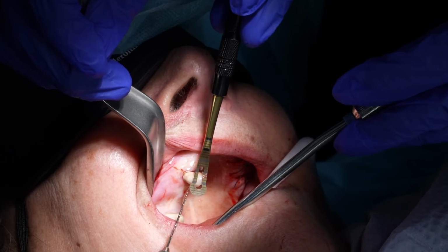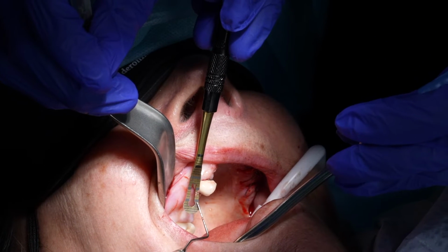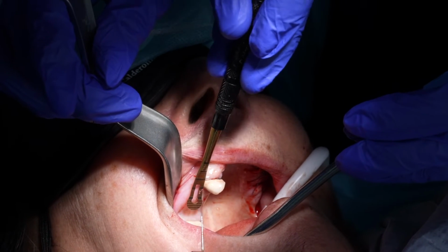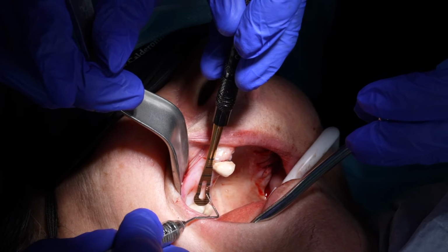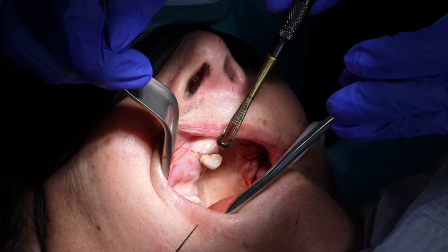Or I can use the fancy instrument over here that I'm showing you, which each line is 1 millimeter until you get to the wide line. Then it's 5 and 6. So every wide line is 5 millimeters. So if I put this right against the tooth here and come over here, 17 millimeters. 5, 10, 15, 1, 2, 17. To the naked eye, I don't have to worry about anything.